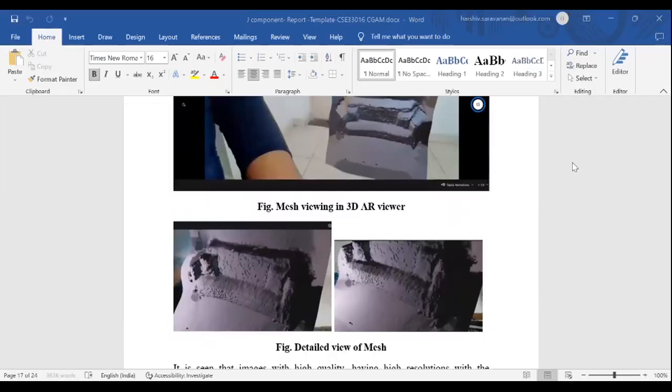So what are the challenges that we faced while developing this project? Getting masked images of the dataset is difficult. Such a public dataset was not available. A proper MRI dataset for our own application is not present as open source due to many laws regarding patients' privacy. So we used datasets that are generally used for segmentation procedures and models.